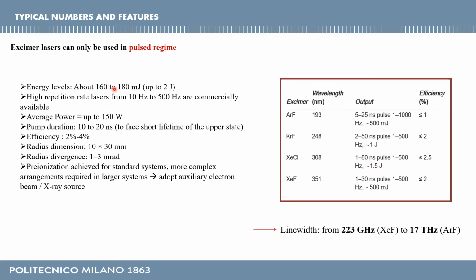But for instance, clinical applications, even regarding laser eye surgery or so on, they can span even in this lower range. Then we have high repetition rate lasers. They go from 10 Hz to 500 Hz that are commercially available. And here we even span between 1 and 1000 Hz, so we have these kind of exceptions, but more or less the range is this one.